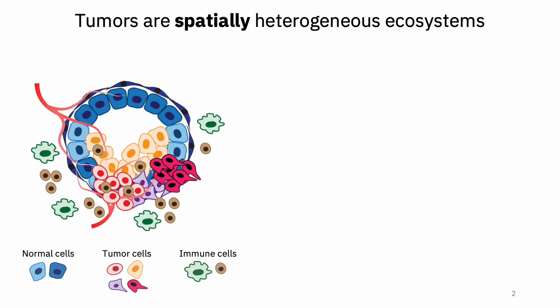They can compete with each other for nutrients or oxygen, but they can also cooperate with each other and, for example, share certain types of factors that they produce, like proteolytic or angiogenic factors. And what we try to do with ATHENA is to actually capture a few of those characteristics in this microenvironment and quantify them with different methods.